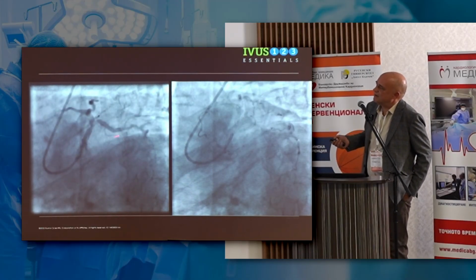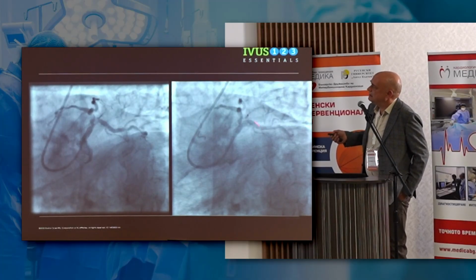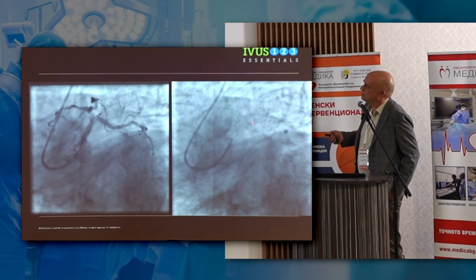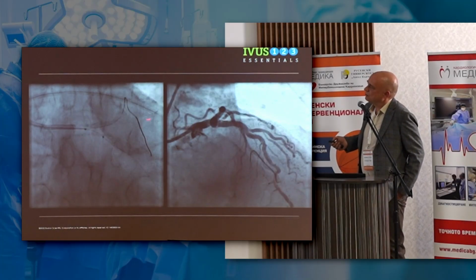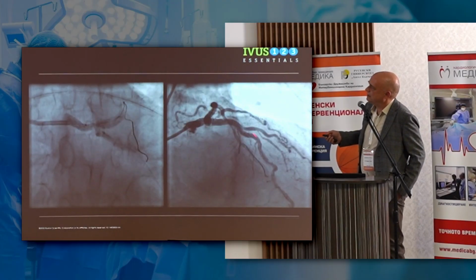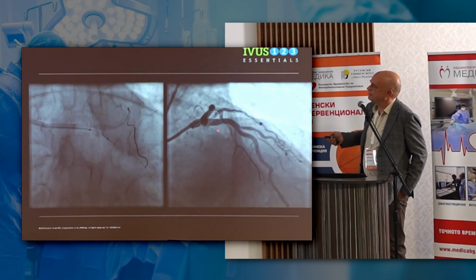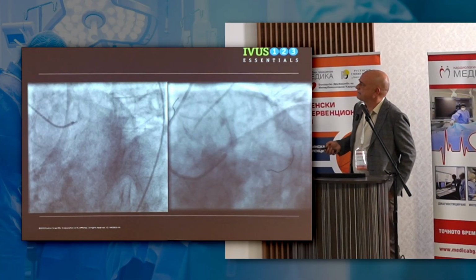So here you have a heavily calcified left main. This is a rota case, and this was the final result after plain balloon angioplasty. You can see here there is a residual problem in the proximal LAD. Also here, heavily calcified left main. I chose that AP cranial. You see here, stent dislodgement while they tried to put it on the ostial circ, but it went downstream to the diagonal one and they just left that.